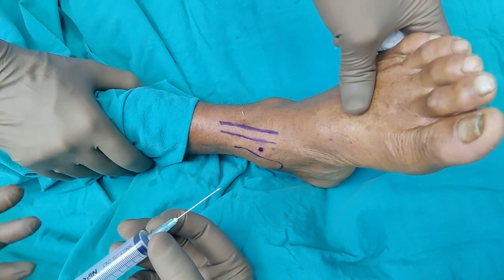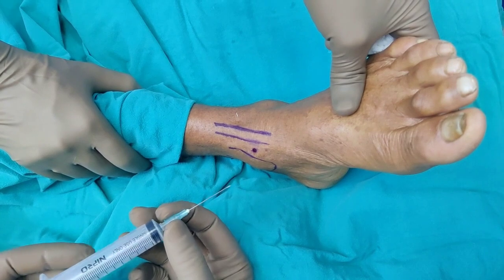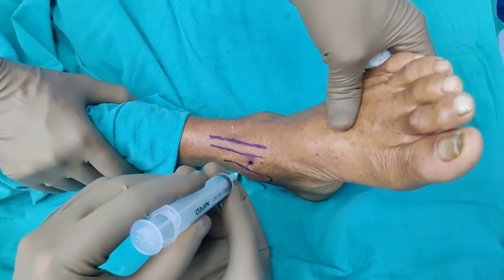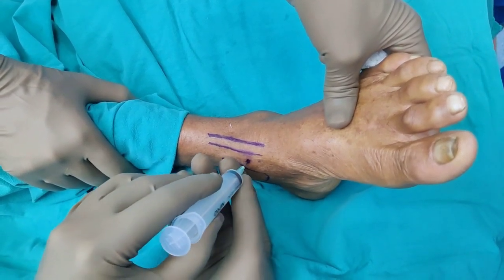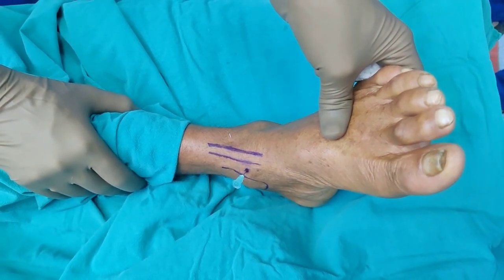If you want, you can use a large spinal needle, but I think the ankle joint is not far off, so a green needle is usually sufficient. I am just going to go in the same area and try to go into the joint, checking the position under the C-arm and readjusting if necessary.